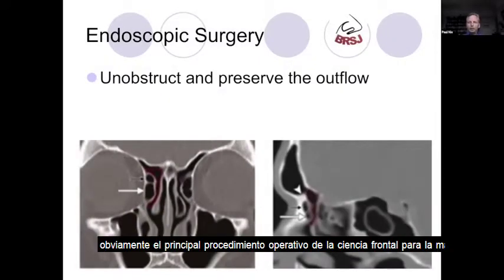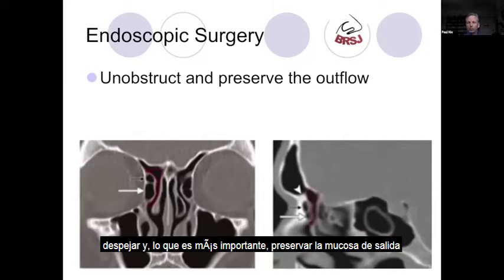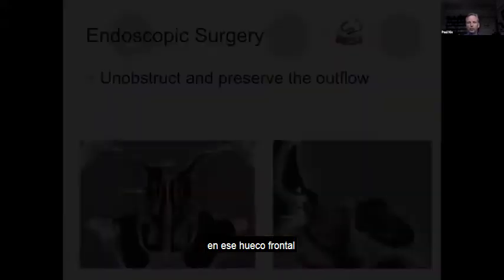Obviously, the main operative procedure for the frontal sinus for most of us will be endoscopic sinus surgery. And my principle is really, we've got to unobstruct and, importantly, preserve the outflow mucosa on that frontal recess.